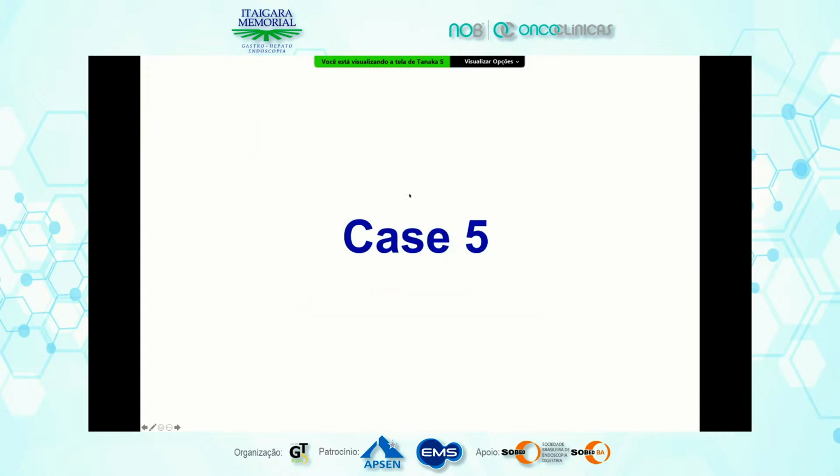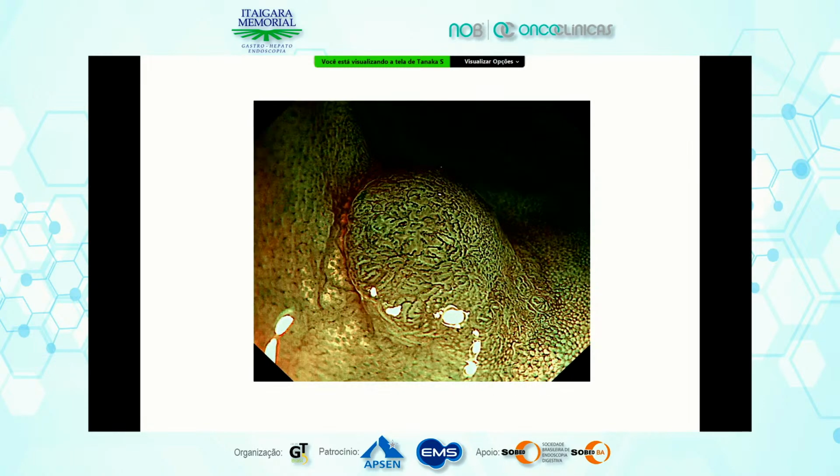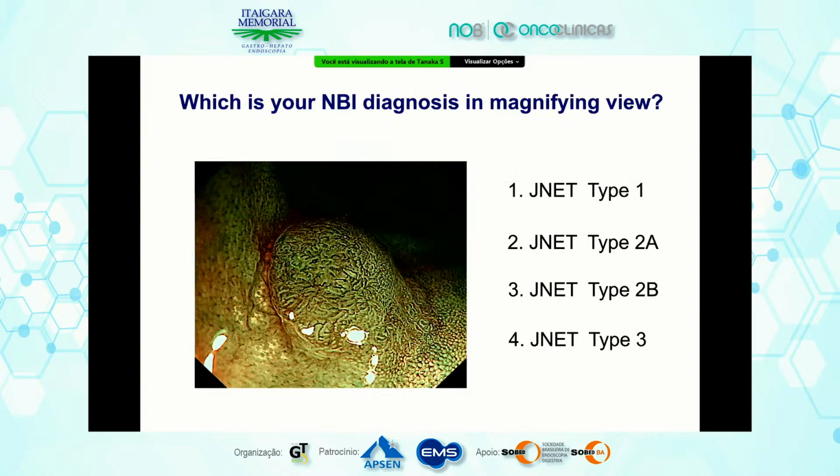Case 5. This is a very tiny polyp. This is NBI magnifying view. Please vote.